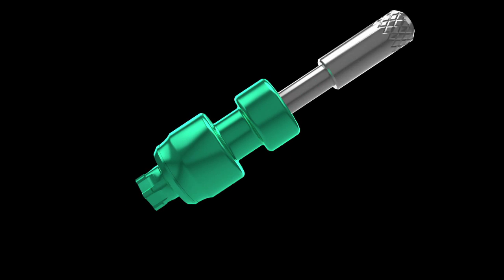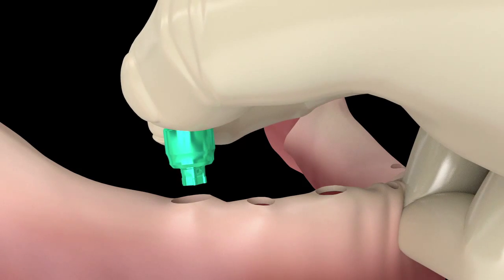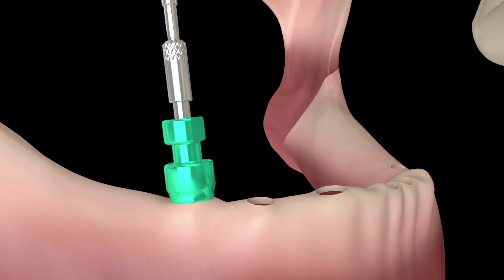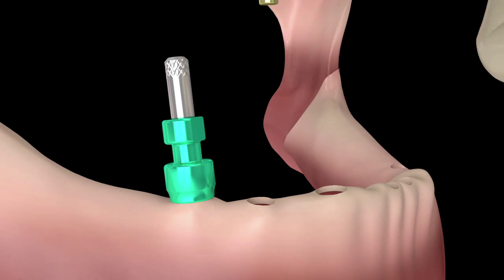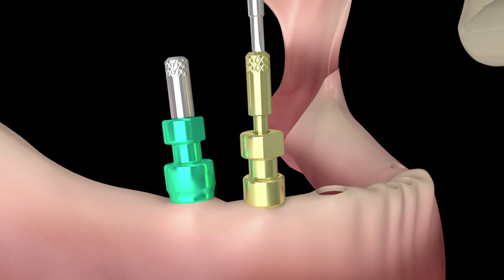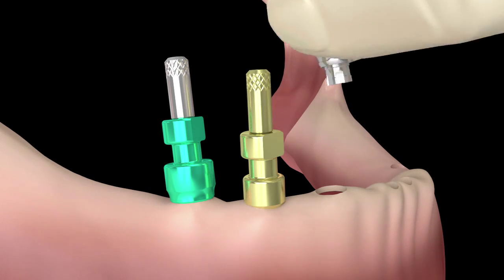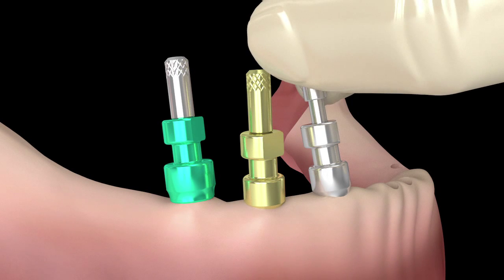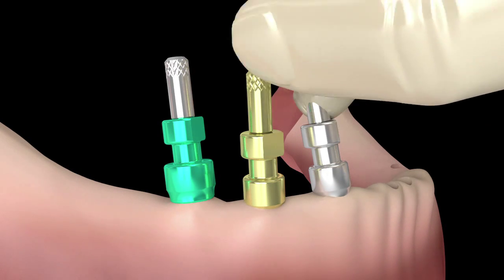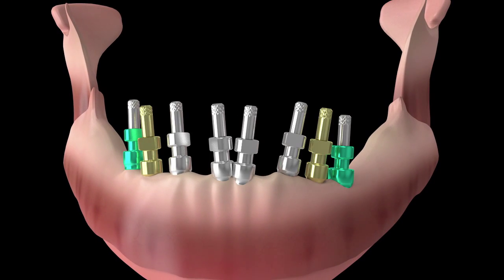They consist of two segments precisely indexed and secured to the platform by the long impression screw. Smart Transfer Copings are placed on the respective platforms with the contra-angle driver securing the coping to the implant. Each transfer component is color-coded for each implant platform: green for wide platform implants, gold for SQ2 platform implants, and silver for the standard platform implants.